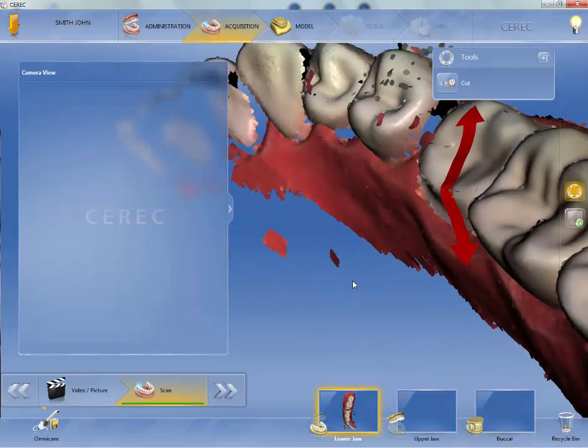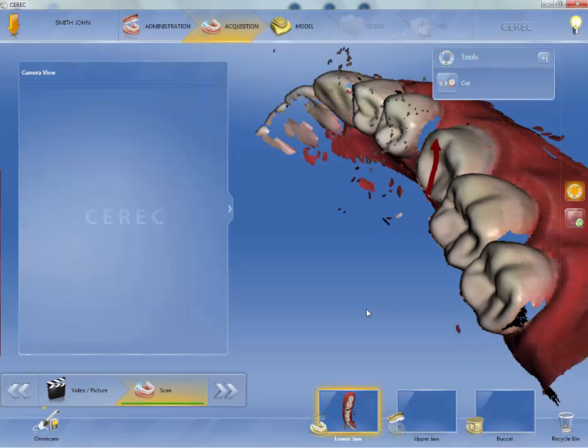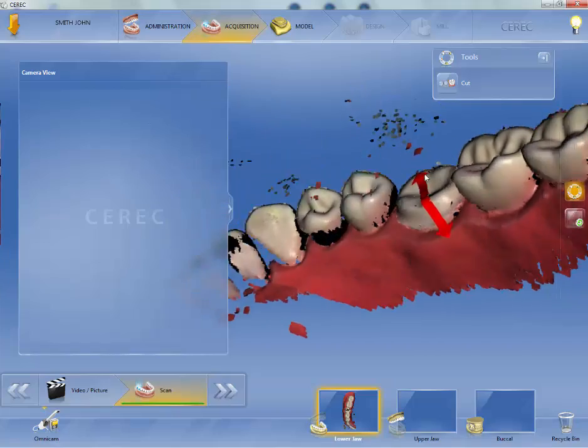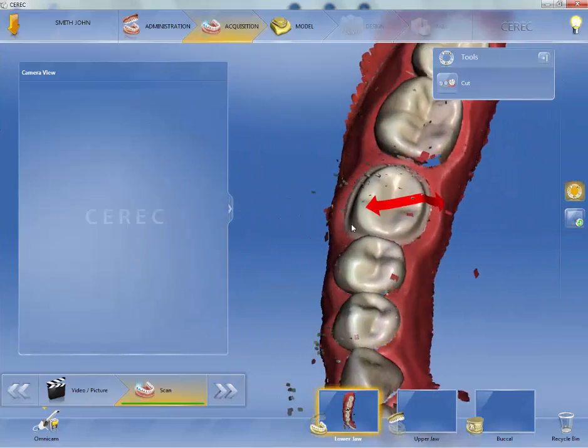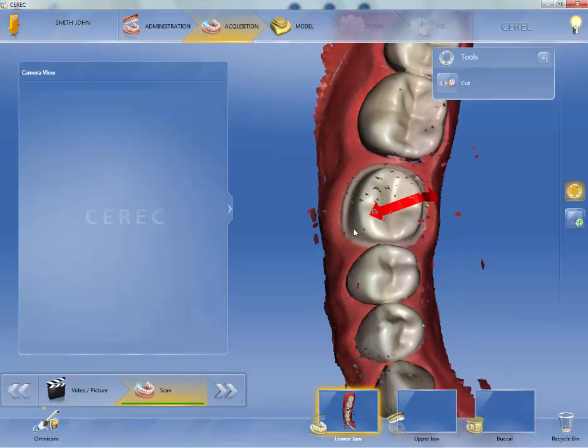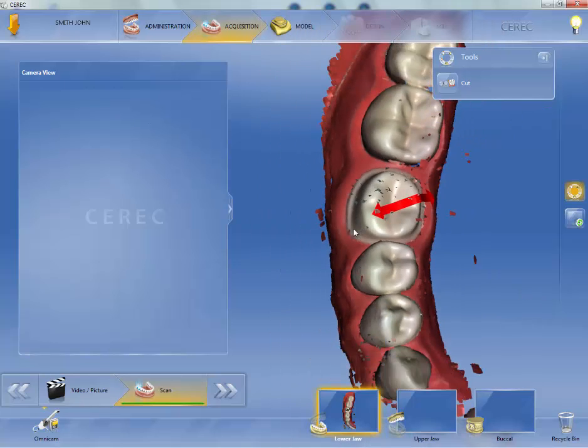The scatter, well, there's a couple of reasons for this. I have a bright light next to me, and that light is causing a little bit of interference, so I need to shut that off. And the other thing, this is just scatter, and it will be thrown away. It won't be there. So what you'll do is, after you've looked at this, I center click and blow it up so I can evaluate if I have everything.